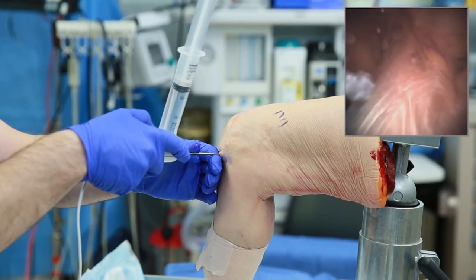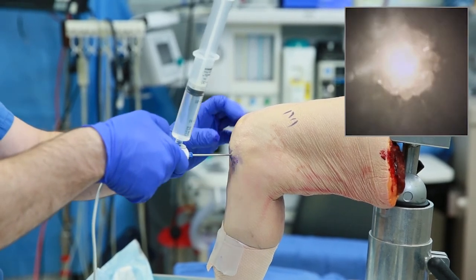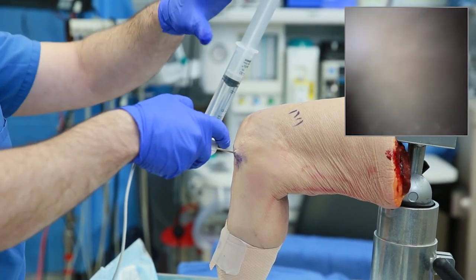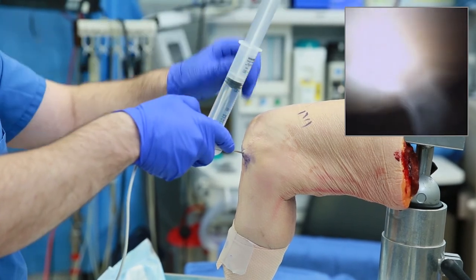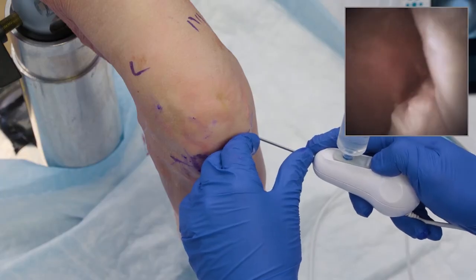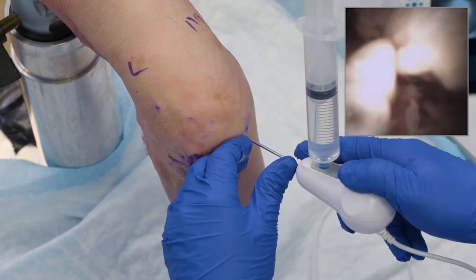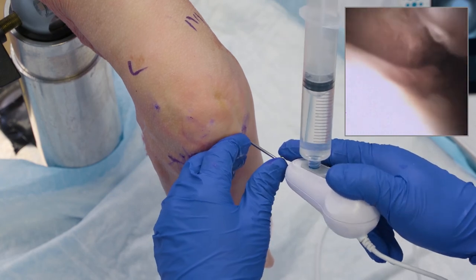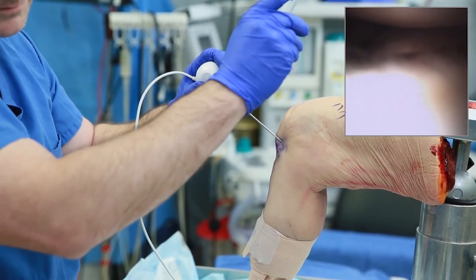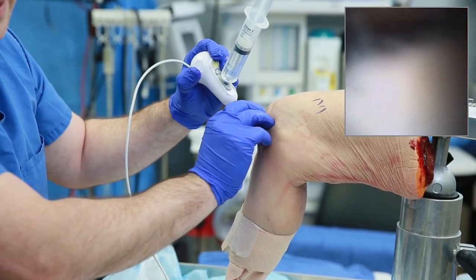Pulling back and looking at my ACL fibers there on the femoral wall. If you fall back through the fat pad, retract your optics, push straight back in until you feel a push-through or a pop, and you're back inside the joint. Get rid of any synovial tissue by blowing it off the end of the scope with a flush — no more than one to two cc's. Pull back again to evaluate ACL fibers, then swing over into the medial compartment. Getting right into the medial side allows me to see my posterior horn and medial meniscus. I can extend the leg to look at it dynamically, then swing around further to look at the mid-body as needed.